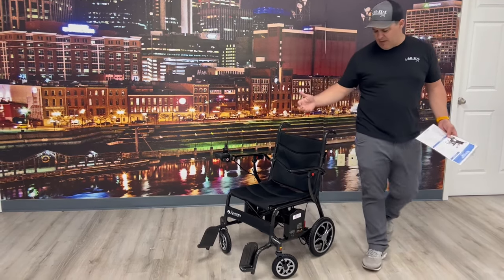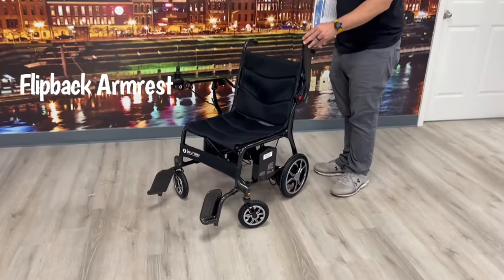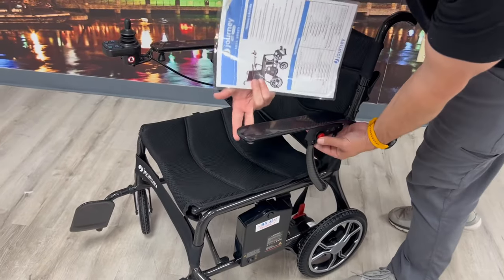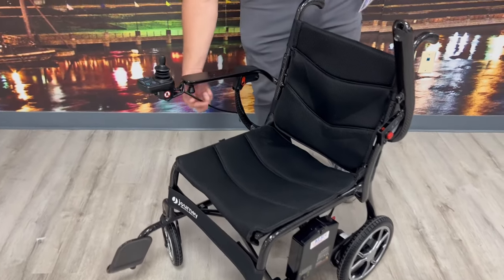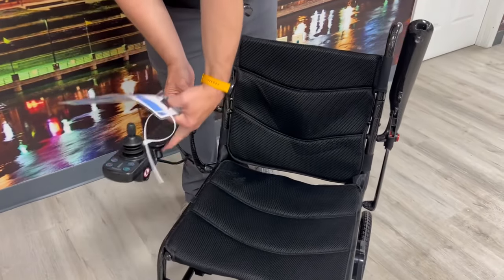Some other key features: it has flip-back armrests, which you don't find a lot on folding power chairs or scooters, but this one has them. You can also put the remote on the right or left hand side just by inserting it here, so it's very easy to switch sides. Both arms do flip up.